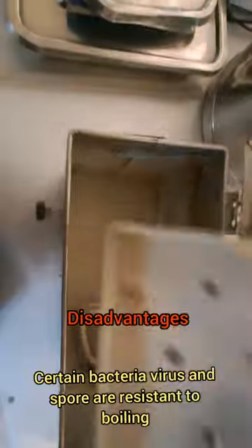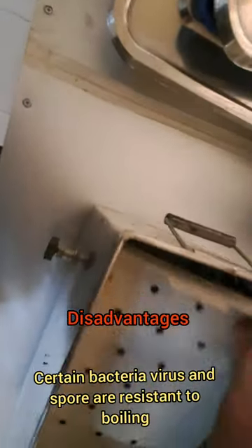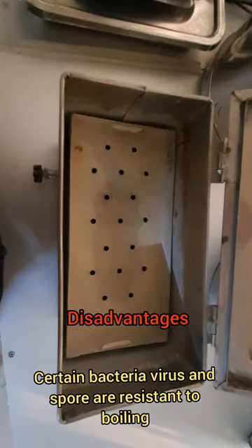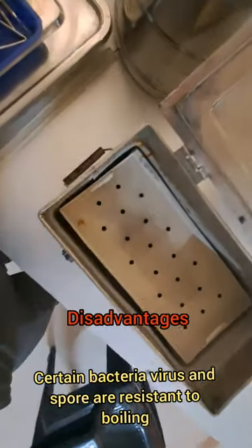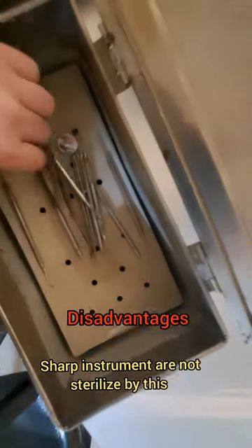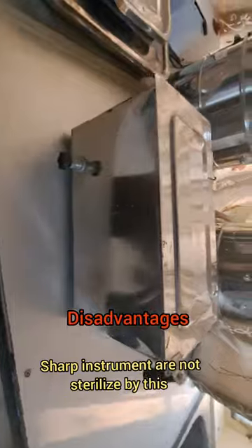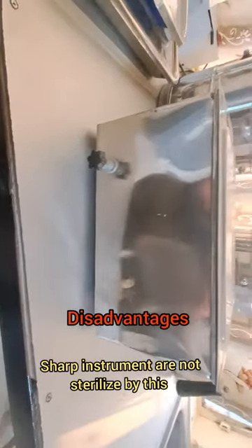This method has certain disadvantages. Some bacteria, viruses, and spores are resistant to boiling. This method cannot be used for sterilizing sharp instruments, which are damaged by heat and moisture.